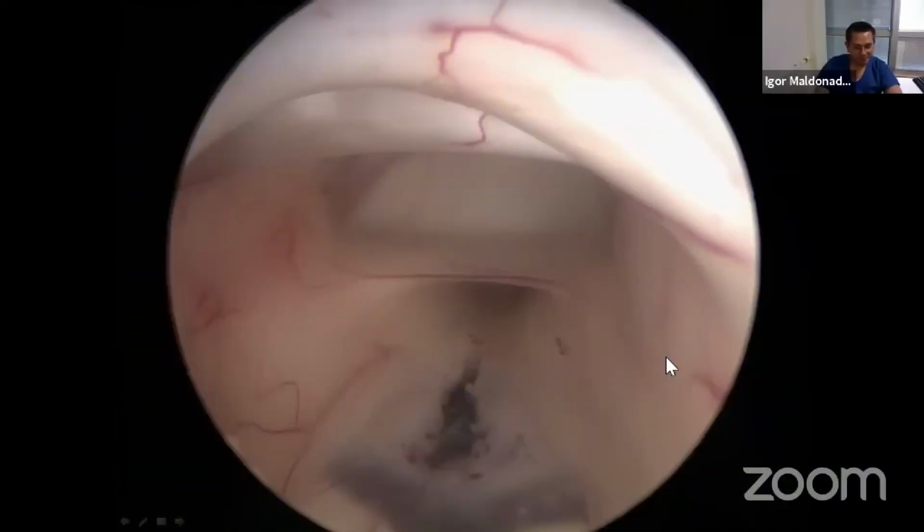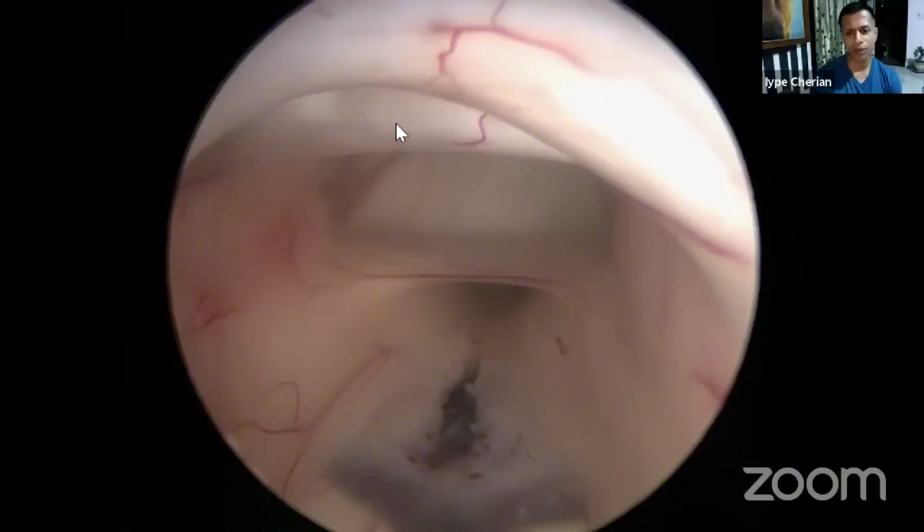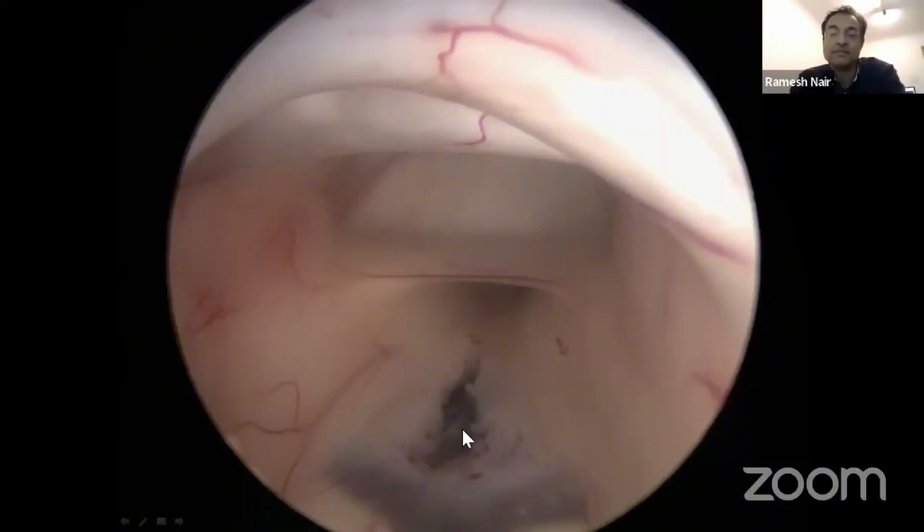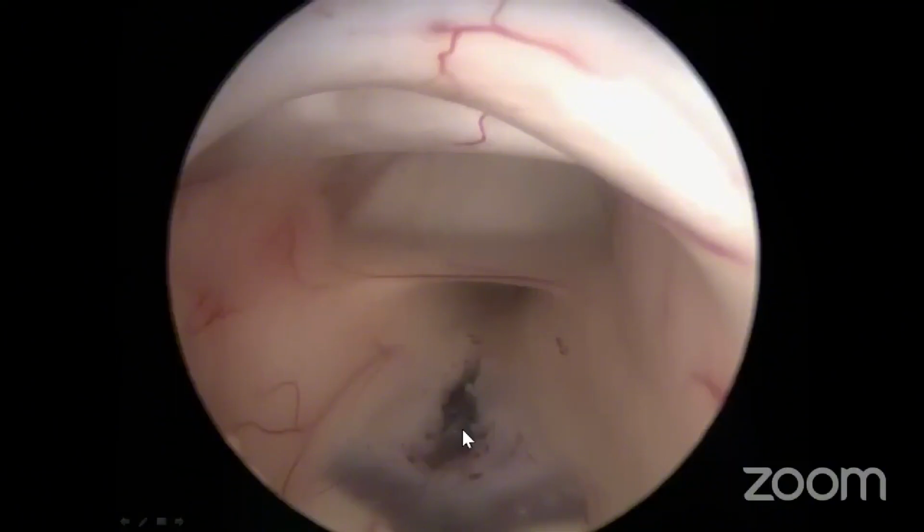Great picture. Now here, what is this? Now we have these three levels. What is this structure? Fornix. Anterior commissure. Chiasm. ETV. Too easy, Henry, too easy.